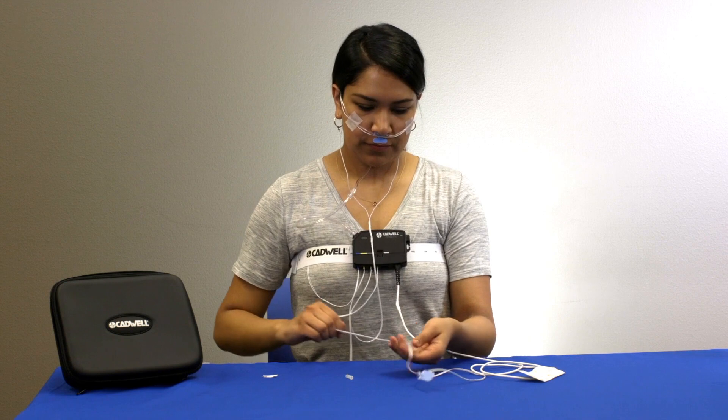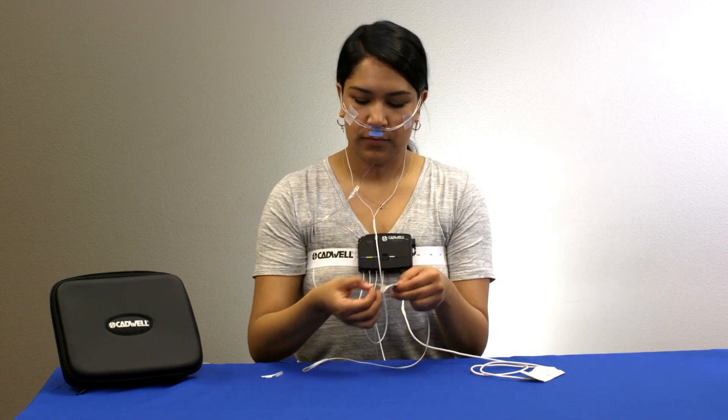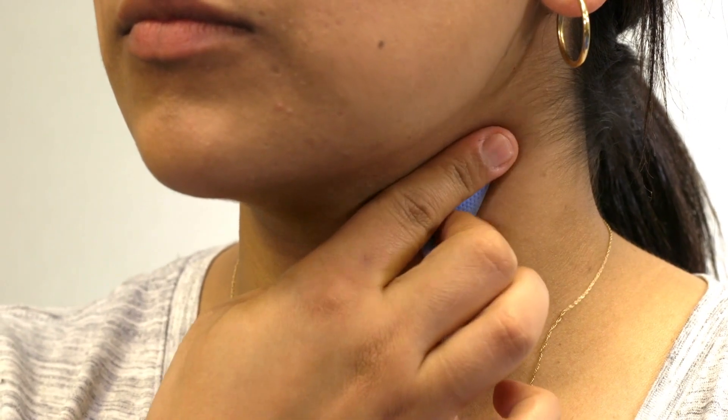Remove the adhesive backing on the snore sensor and place the sensor against your neck. Push to ensure the sensor is secure. Use additional tape if needed.